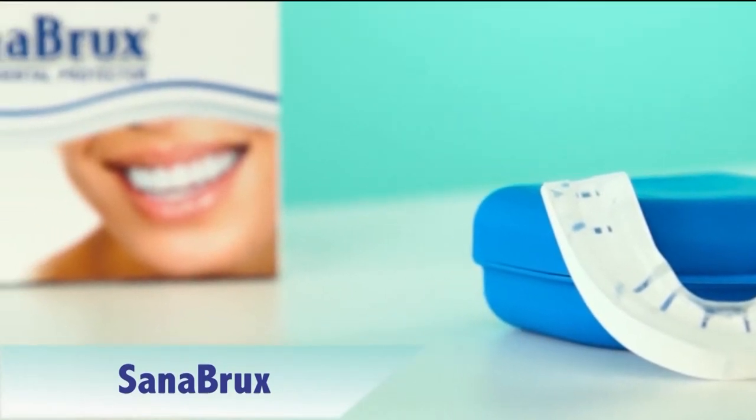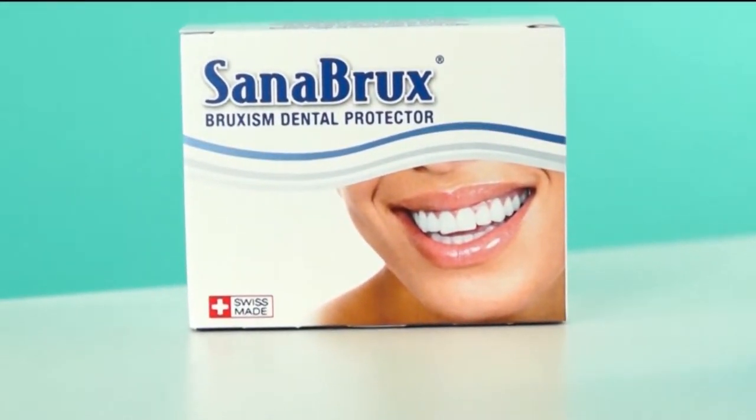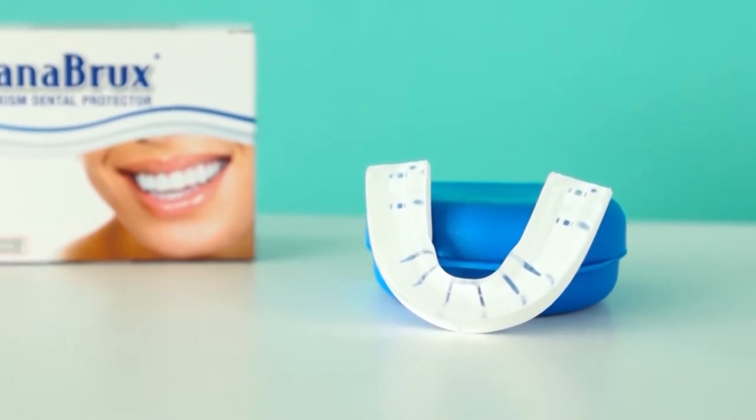The SanaBrux dental guard prevents grinding. The soft, individually fitted inner part of the dental guard effectively protects the teeth. At the same time, the mouthpiece is embedded in a fixed sturdy shell that is stable and of great quality.